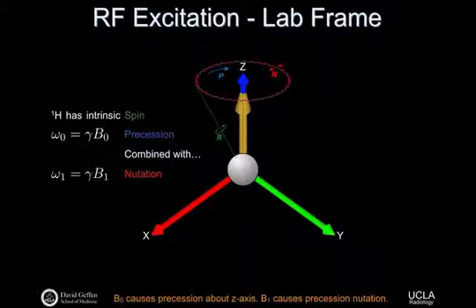Okay, so if you look at this red sort of modulation here, this is kind of a high frequency modulation or somewhat high frequency modulation. Imagine if it only went through a nutation of, say, pi over 2 in one revolution, then the magnetization would bam hit the y-axis or maybe the x-axis. So again, think in terms of scales a little bit here as we work through some of the next problems, and appreciate the difference between spin, precession, and nutation.